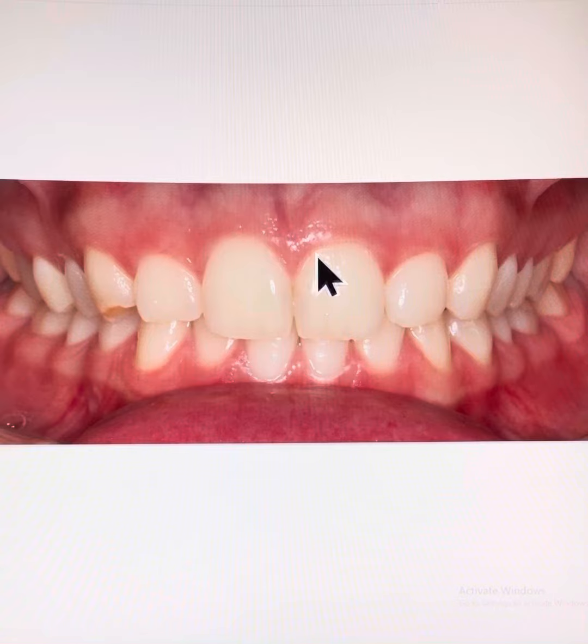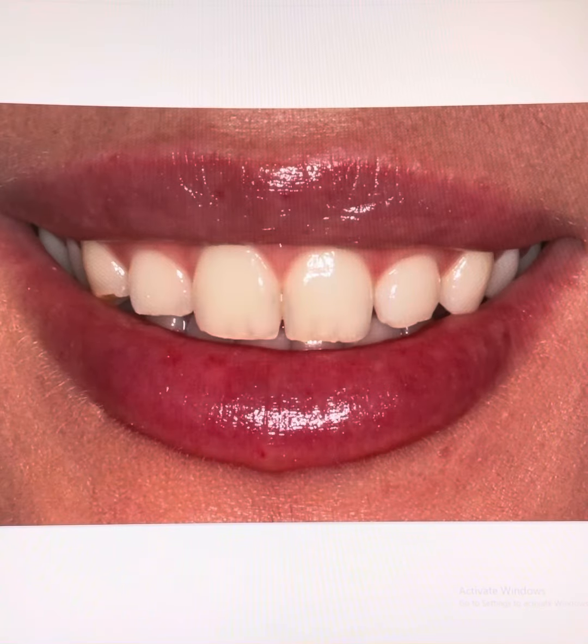The gum line along the upper front teeth are not fully symmetrical on the right-hand side and left-hand side, but when the patient smiles, this gum line asymmetry is relatively insignificant, and so we left the gums untouched, saving the patient some money.